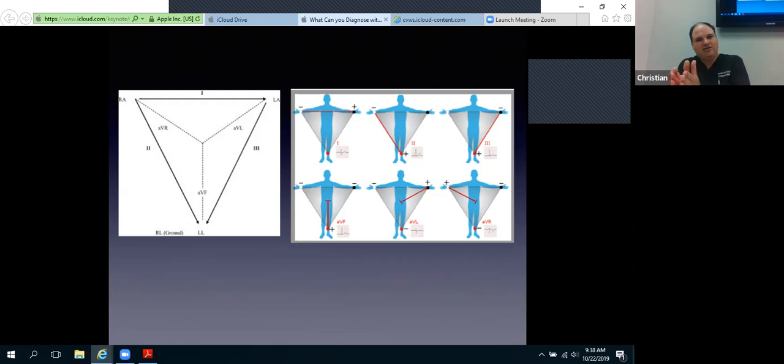So within AVL, because you're using again that left leg and the right arm as negatives, and they're moving up towards the positive here, AVL tends to be still somewhat left-sided, so it tends to be somewhat of a positive deflection. That's what we expect there to be in AVL. But that can be mitigated slightly by the right arm, because the left leg and the left arm are, again, seeing the same side. They're just being mitigated by the right side a little bit.